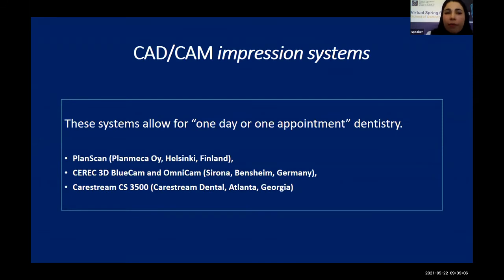On the other hand, CAD/CAM impression systems allow for one day or one appointment dentistry. Examples of CAD/CAM impression systems are PlanScan, Sirona BlueCam and OmniCam, and Carestream CS.